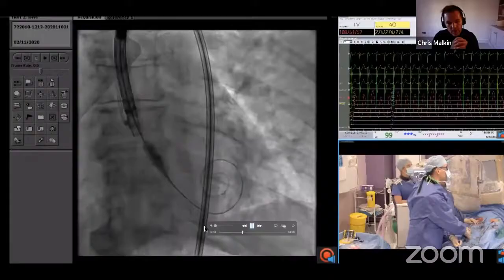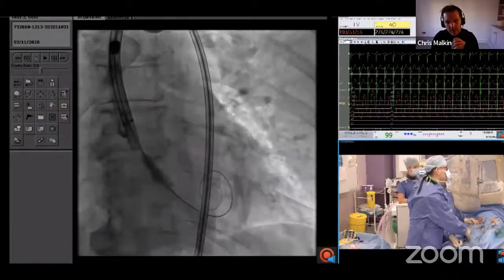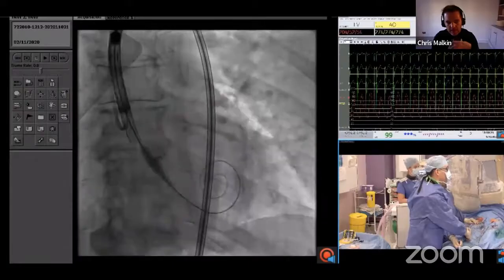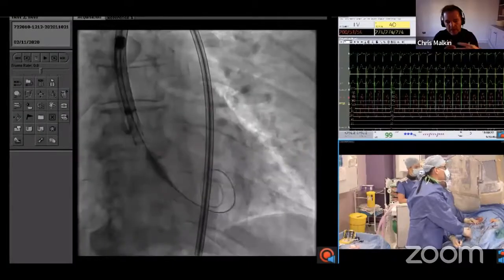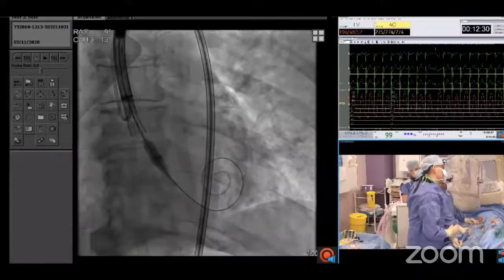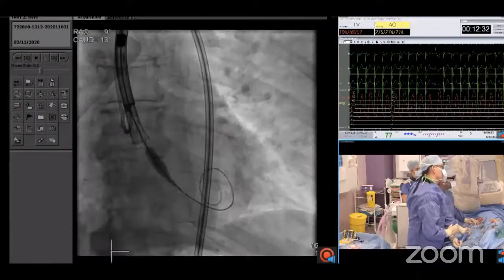So to those of you who've got a good eye at this, you think that the valve looks deep at the moment, but that's an illusion because the pigtail is actually being pushed out of the sinus and the pigtail is floating about 2-3 millimeters high. Actually, my colleague's a bit stressed about that.